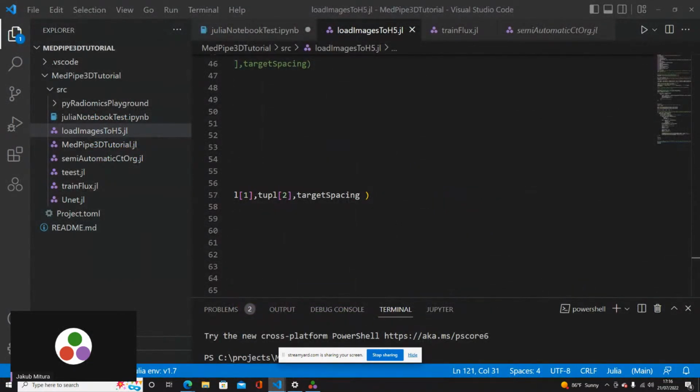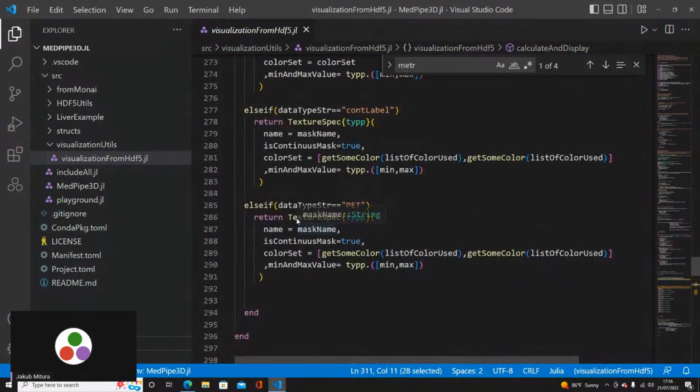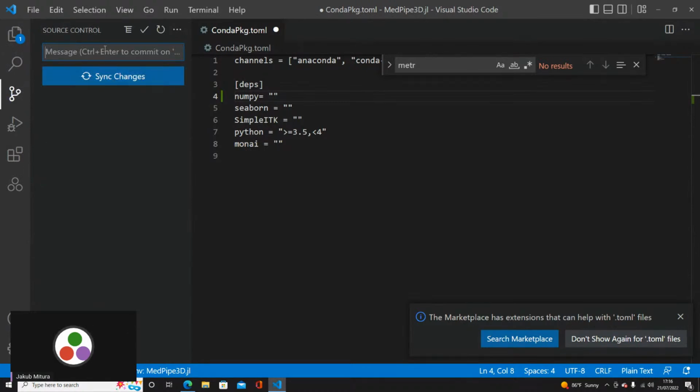Okay, well, can do it like this and fast.